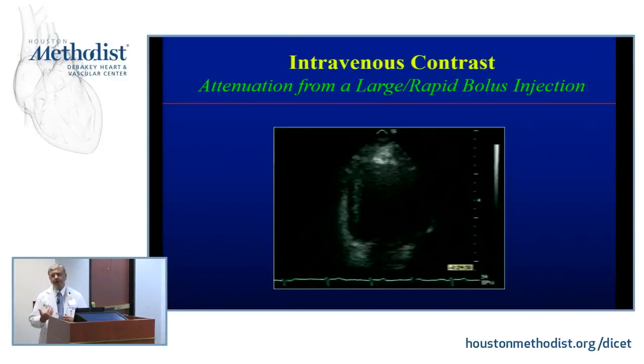Now, one thing I've noticed in the lab, and I would say it's beyond this laboratory here, is to try to really understand what goes on in contrast from an interpreter point of view, understand some of the advantages, limitations, knobology that is needed, and if you see an image, to be able to tell whether this image is not good because of what is the issue.